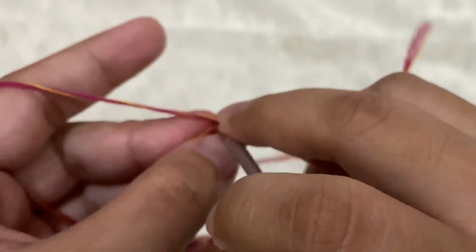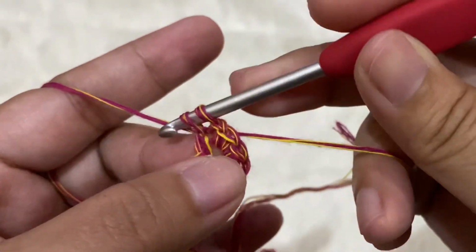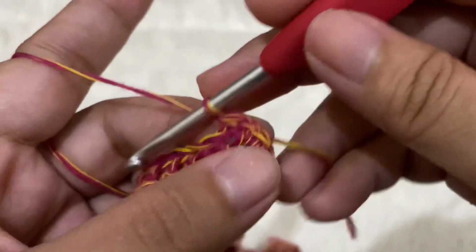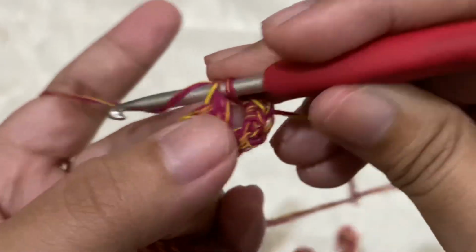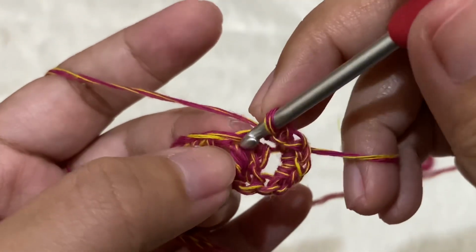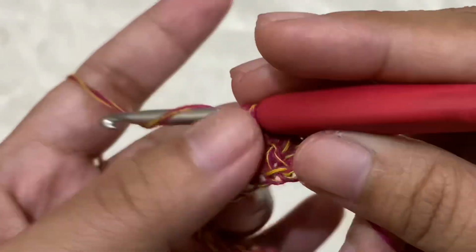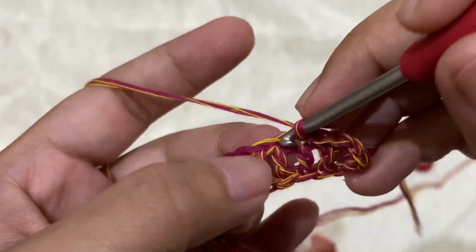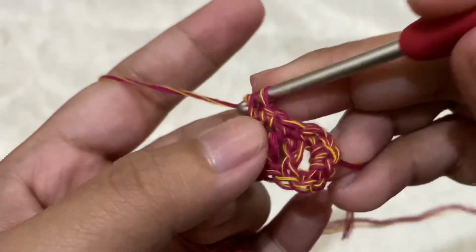It actually doesn't have to be perfect, just make sure that you reach the other side. Okay, so when you're already on the other side, just keep on making single crochets on each stitch. Alright, so just keep making single crochets and see you in a while.